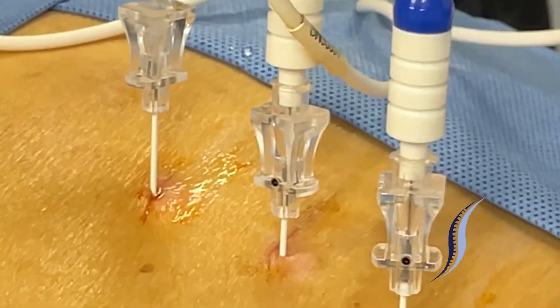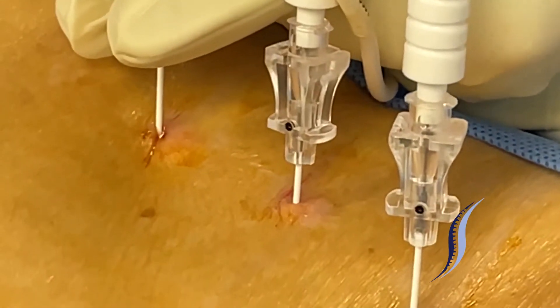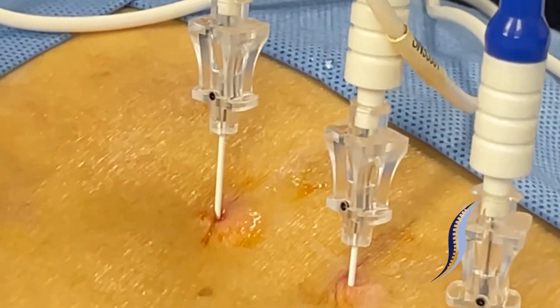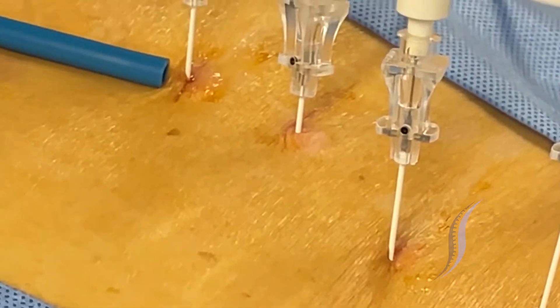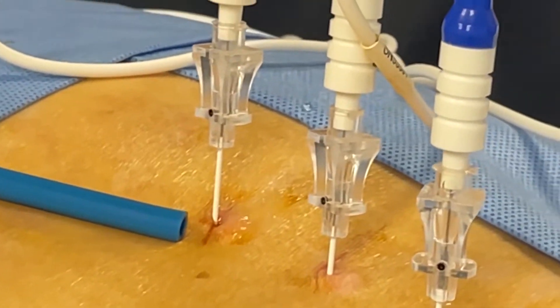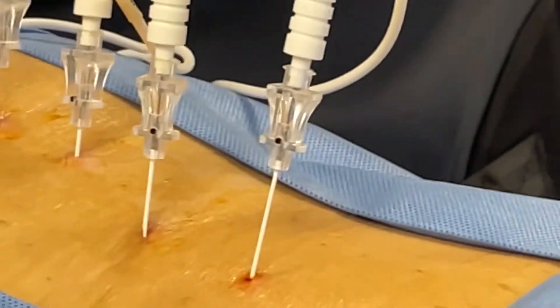So we have the L2, L3, L4, and L5 dorsal rami at the level of the pedicles of the L3, L4, and L5 vertebral bodies. Again, this needle for the L5 dorsal ramus is at the junction between the sacral ala and the superior articulating process of S1. So now it's testing time.